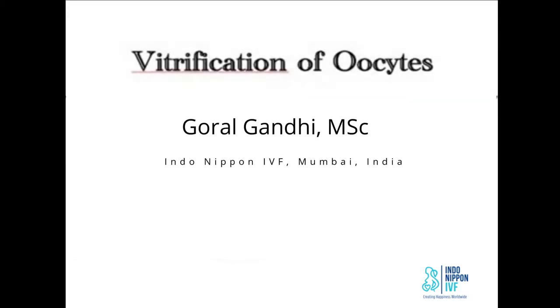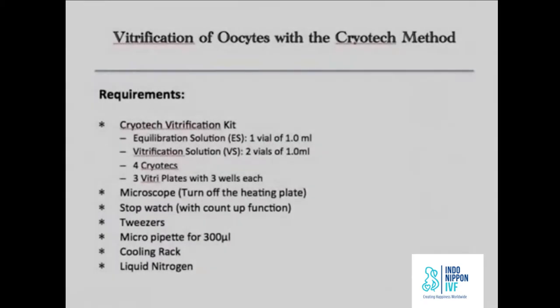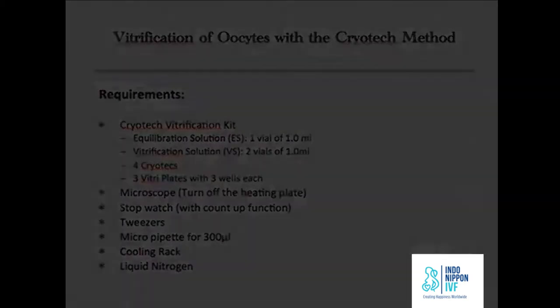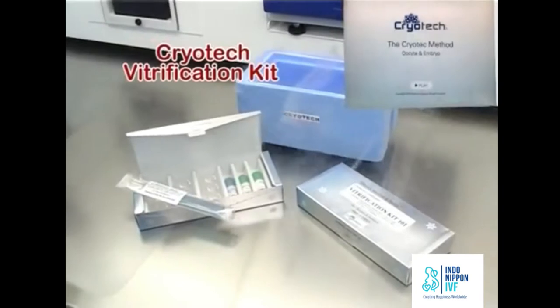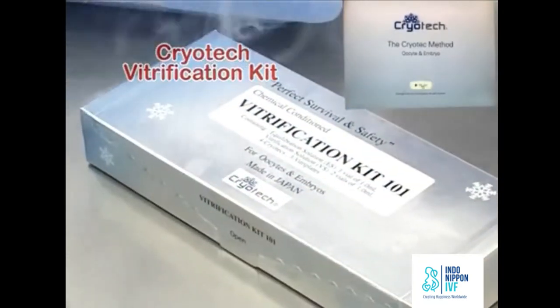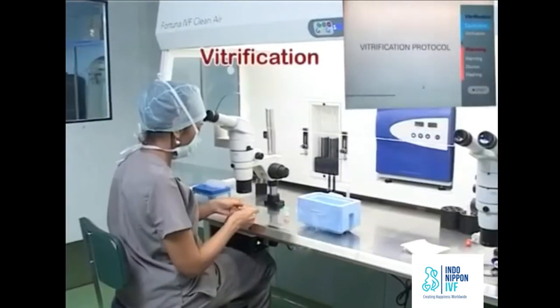Vitrification of oocytes using the Cryotech method. Before beginning the process, ensure that the microscope stage heating is turned off and the room temperature is around 25 to 27 degrees centigrade.